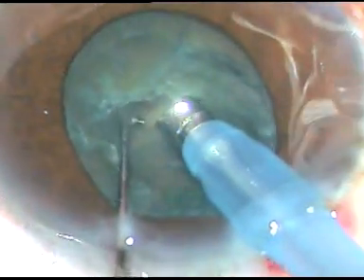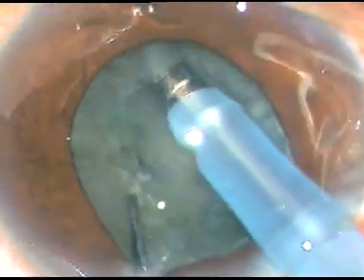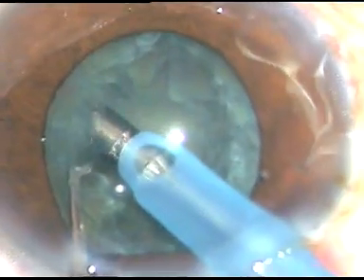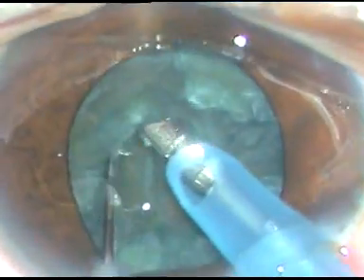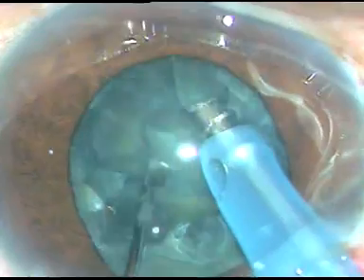Since this is a soft cataract, I am not able to hold it. I just try to give some support and do a mechanical chop — support it without using vacuum and try to slice the nucleus. I have been partially successful. There has been a crater at the center, and I am not able to take one hemi-nucleus out of the capsular bag. As I try to hold it, it just comes out. Vacuum has been reduced; still it's not holding.